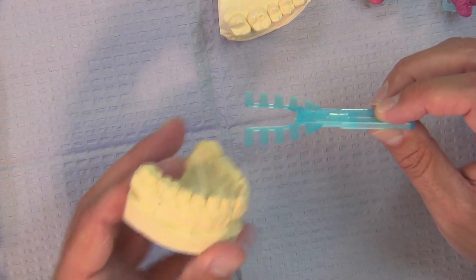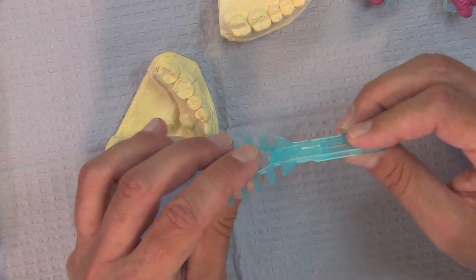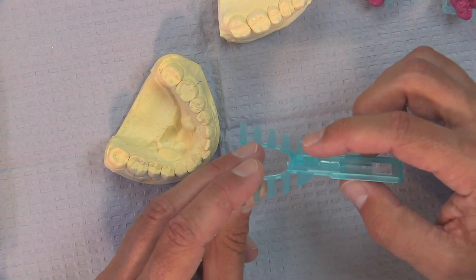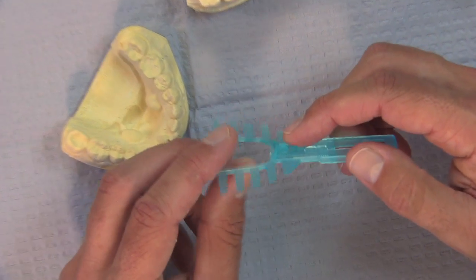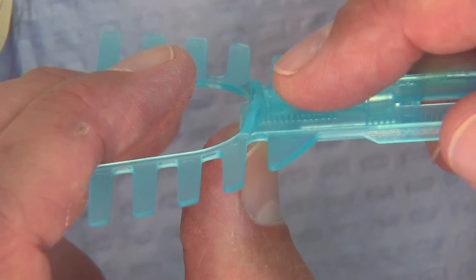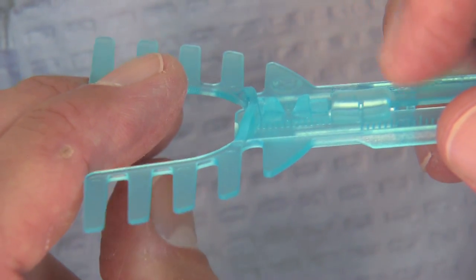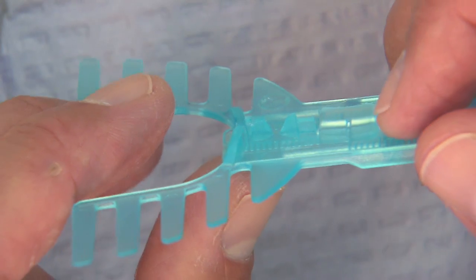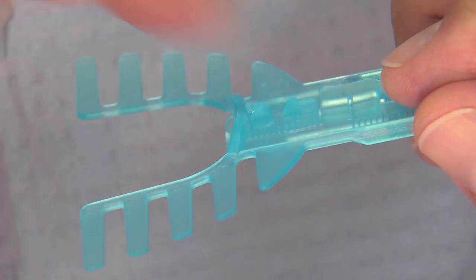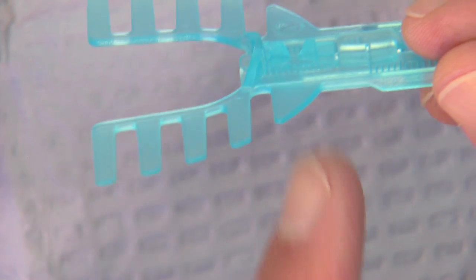And then with their lower jaw, they're going to bite into the notch on the lower. And if you can see the two notches right now, we've got the upper notch here, and the lower notch is slightly retrusive to that. So the first thing we want to measure is the patient's normal bite. So we have the patient open and close a couple times on their own, then we put the gauge in their mouth, we put 8 and 9 into the notch on the top, and we tell them just to close in their regular bite. Sometimes they have to move a little, but most of the time they close right into this lower notch.